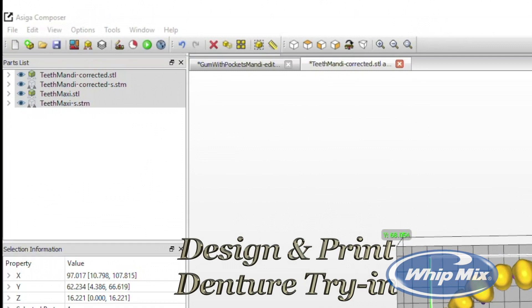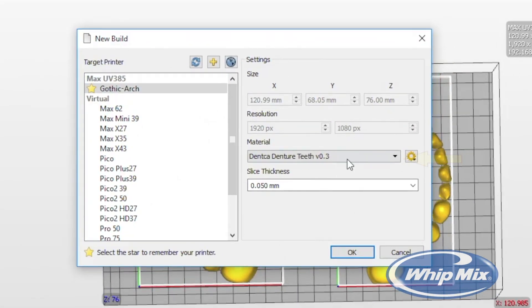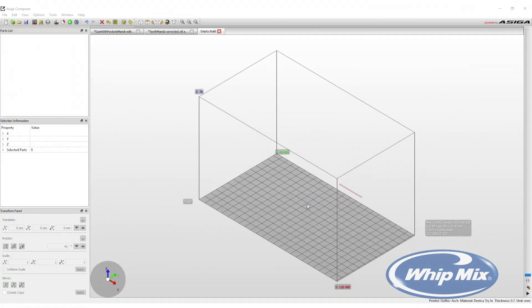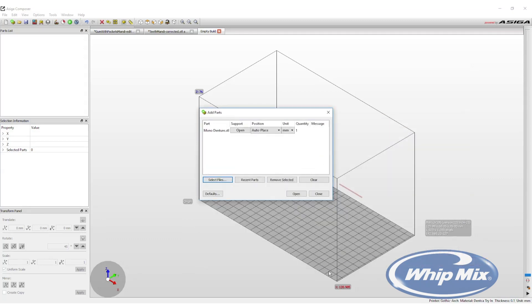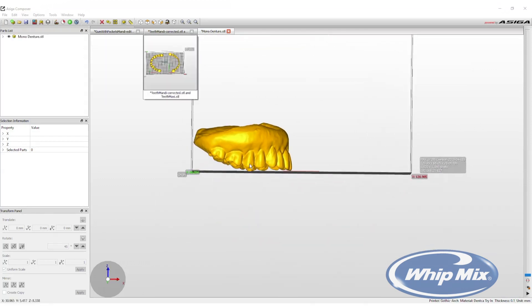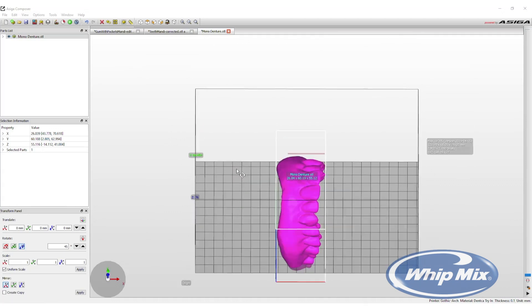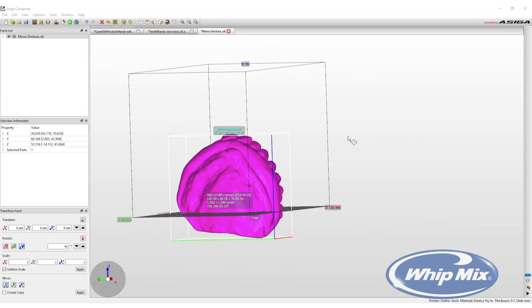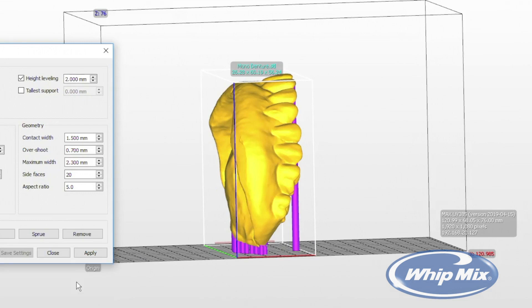To print a denture try-in, start a new build by selecting the New Build option in the top options line. Click the drop-down menu and select the try-in material. The slice thickness must be at least 100 microns, which can be changed in the slice thickness drop-down menu. Press OK. Click Add Parts from the menu bar, then click Select File and find and select the try-in file. Press Open and then Open again — the try-in will now be imported into the print software. The bases print best in the vertical position to reduce the number of supports. If the design appears pink, it is outside the print envelope. If the try-in is out of the envelope when Add Supports is selected, the program will automatically place it within the envelope parameters before adding supports.